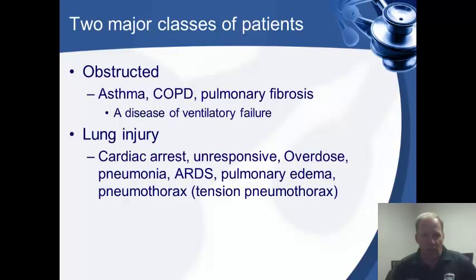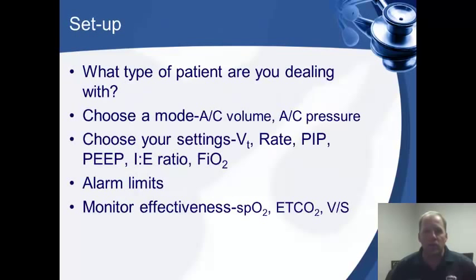Everybody else kind of fits into the lung injury category. Your cardiac arrest, ROSC patients, unresponsive, overdoses, pneumonias, ARDS, and the like. We're going to basically look at those two classes.